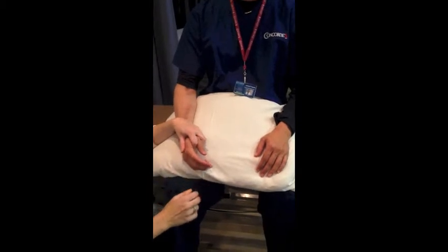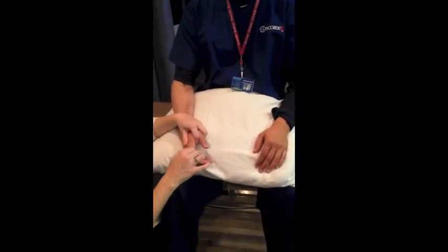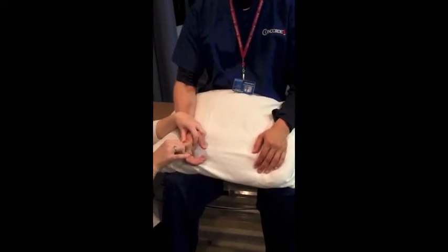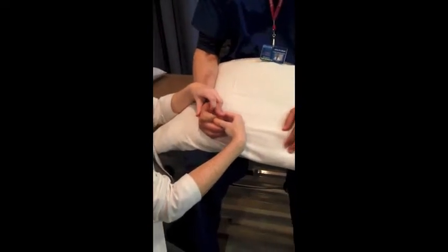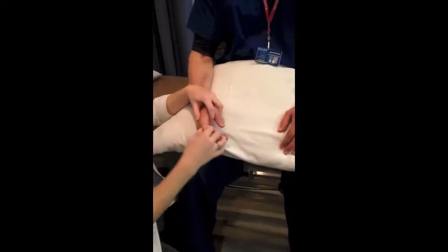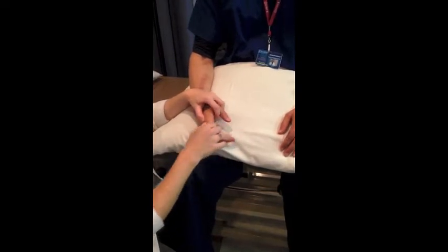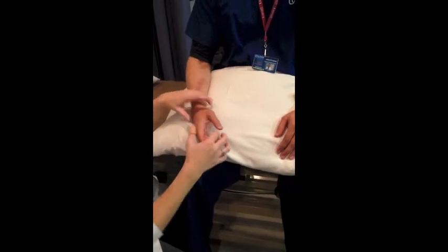I'm going to stabilize the metacarpal and move the first phalange. So we've got extension and we've got flexion. For flexion, we're going to go along the dorsum. For extension, we're going to measure along the palmar-volar surface.